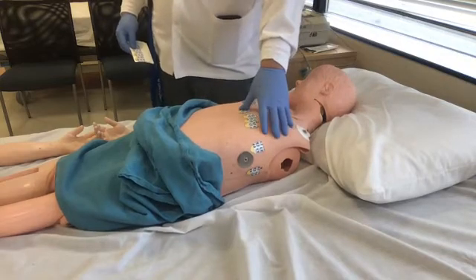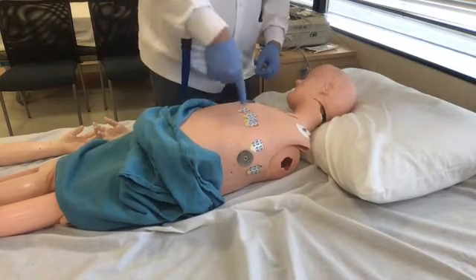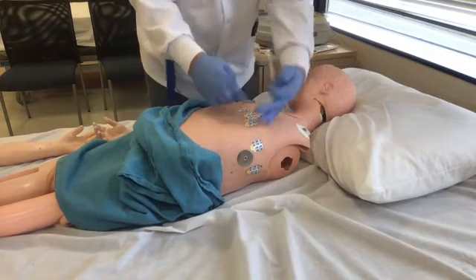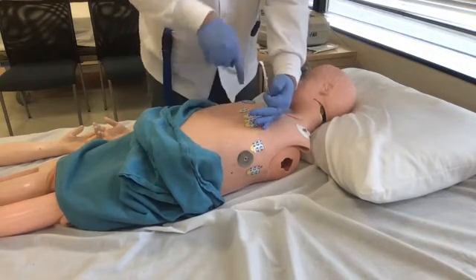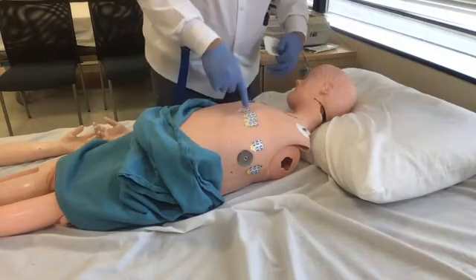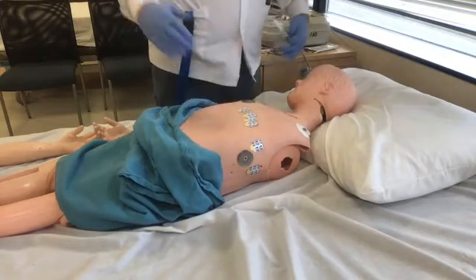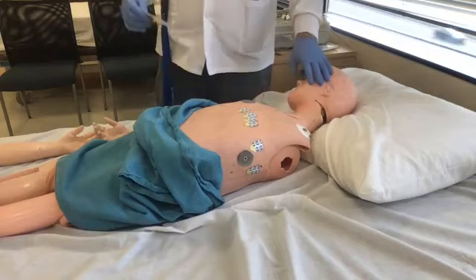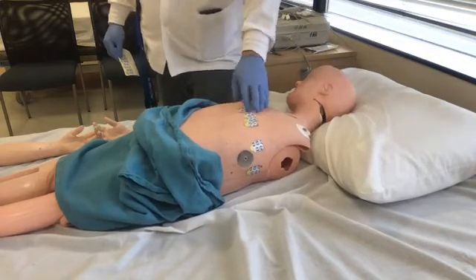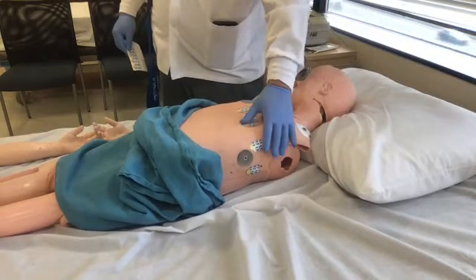Now, how do you deal with that? Well, if you know and understand what these things are, this is a camera pointing where? Here, here, here, here, here. So if you have breast tissue, you can put it on top of the breast tissue as long as it's pointing where? In the direction of this, towards the heart, right? It's good to memorize in a way, so that's why you measure up so you can have an idea. But when there's breast tissue here, it gets a little bit more tricky.